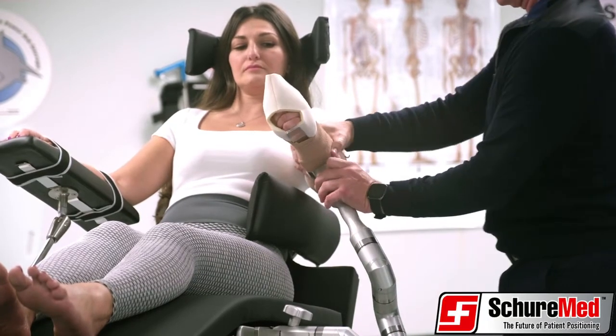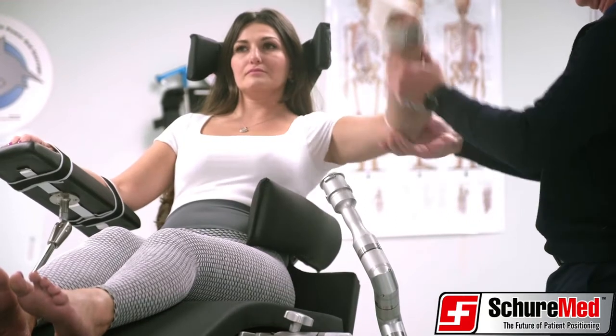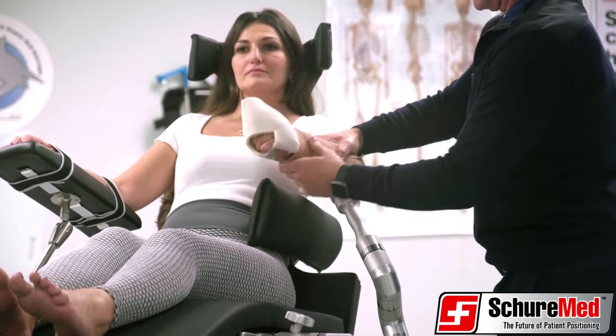The forearm attachment can be disconnected to allow the surgeon to move the arm throughout its natural range of motion, and can then be reconnected to the positioner.